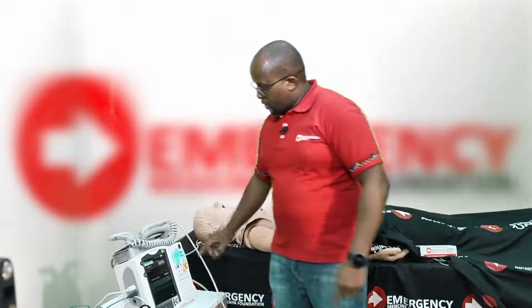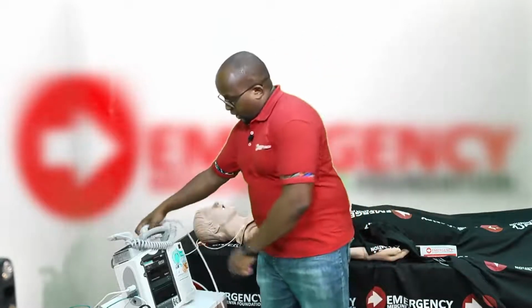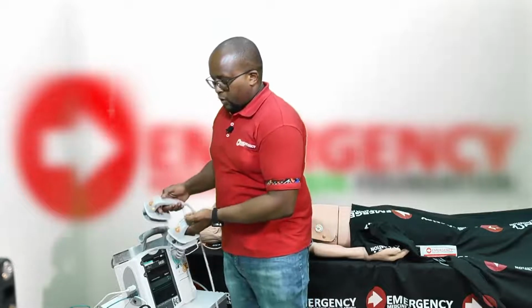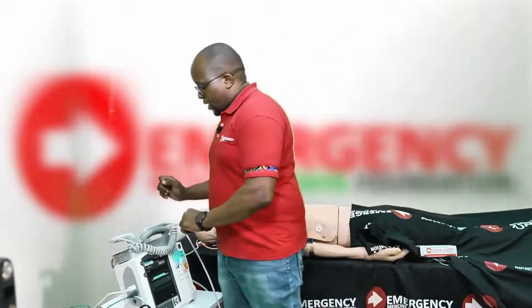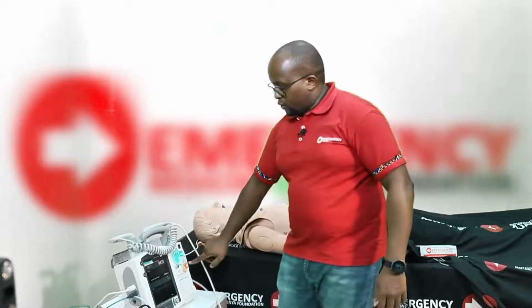So there are two parts of number two. So one here, charge is two, and charge can be done through here. And then three is shock. Shock can also be done by pressing these two buttons simultaneously. So that's number three, and it's labeled number three. So the shock process is 1, 2, 3: select energy joules, charge, shock the patient if indicated, using either of these.